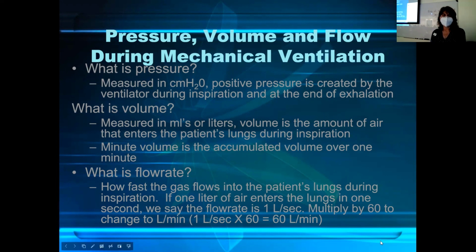And then on the ventilator, the flow rate shows up in liters per minute. So if the flow is 1 liter per second, you don't see that. What you see is liters per minute. That's what's reported.